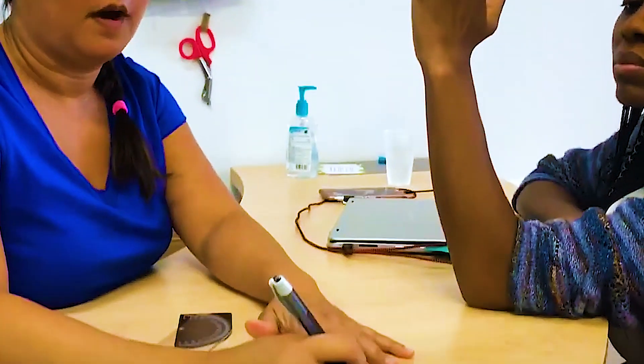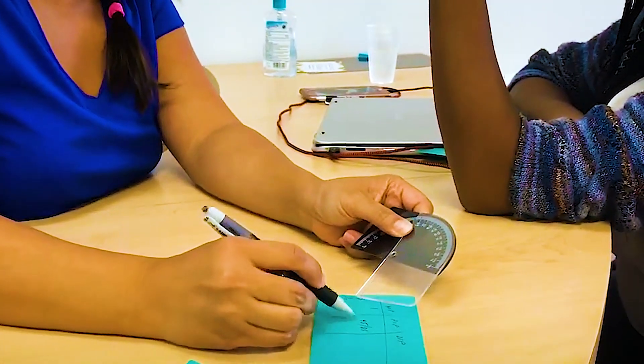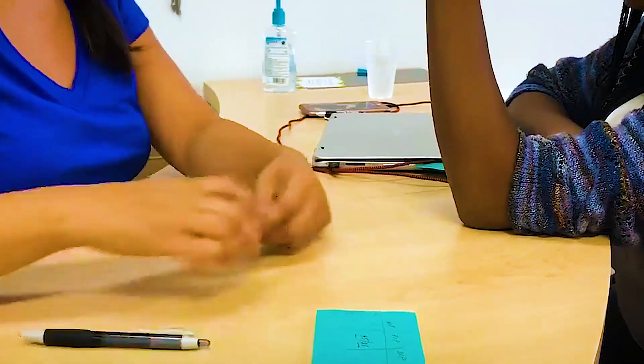In front of the slash is your extension, and behind the slash is your flexion. If their extension is zero, I don't put a slash — I just go straight into the flexion value. If they have a contracture where they can't fully extend, I'll measure that. So this is 45, then I'll put 45 slash, and then flex. So 45 and 85 — the 45 is the extension and the 85 is the flexion.